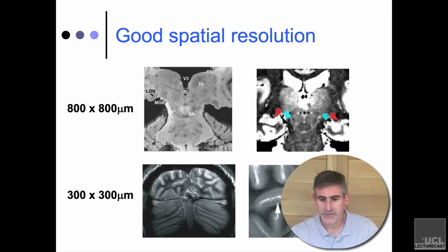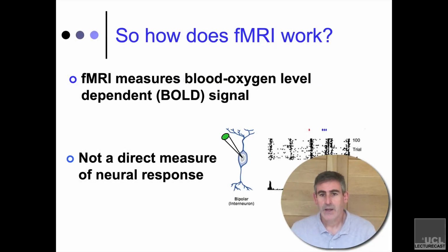Right, and here's just an illustration in the scan, where you can see the lateral geniculates in red and the medial geniculate in blue, just by pushing the resolution and the contrast in the image. As I say, that's structural imaging, that's anatomical imaging, and it's no different in your brain than it is in your knee. If you blow out your ACL or something playing football, it's exactly the same type of MRI that's going to be used to get a nice picture of the soft tissues in your knee.